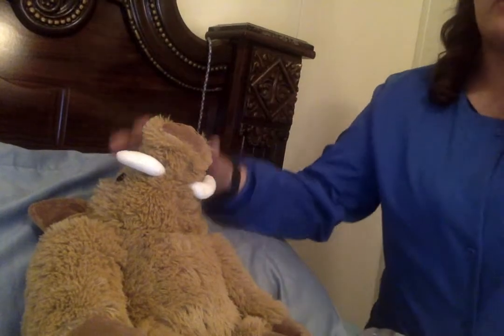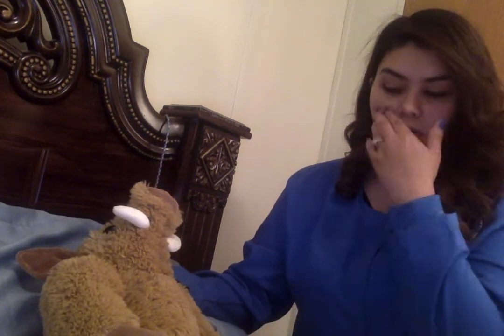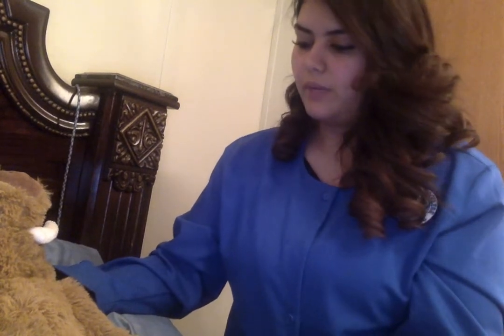The next thing I'm going to do is explain the procedure to the patient. So today we're going to give you a Foley catheter because you've been having some trouble retaining fluid in your bladder, and it's causing you distension, and it's making it really hard for you. So we're going to go ahead and do that. What we're going to do is insert a catheter, and that's going to help your bladder drain. Is that okay with you? Yes, that's okay with me.